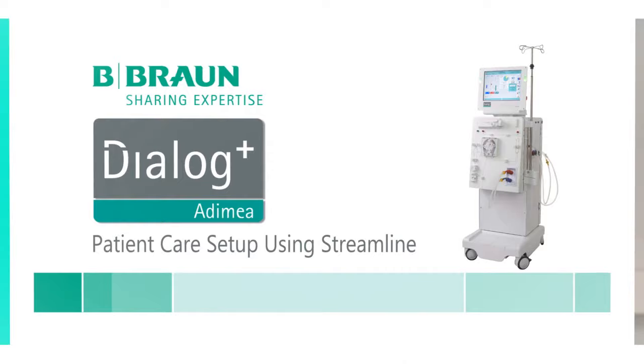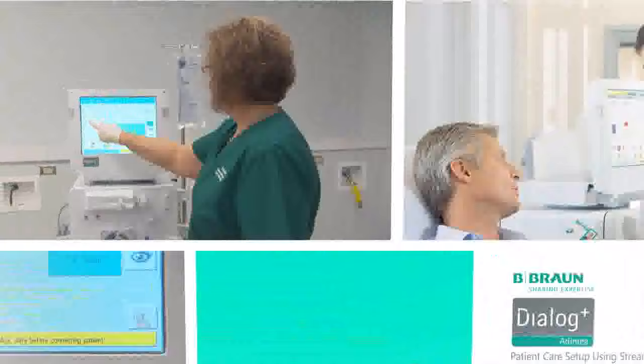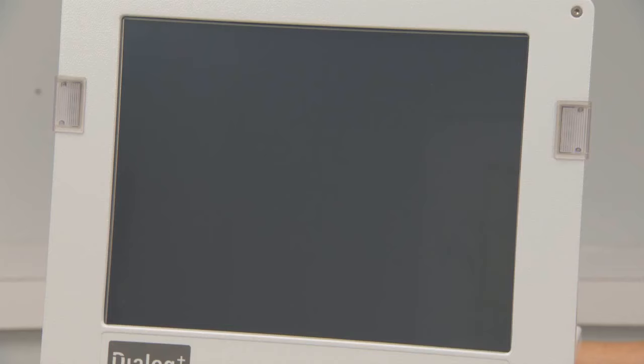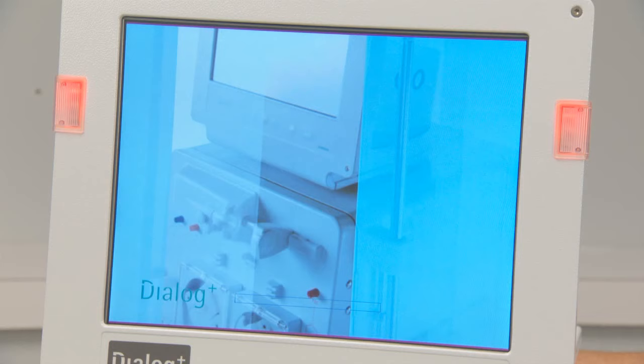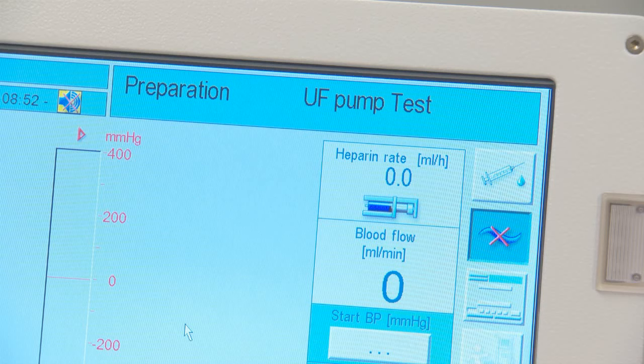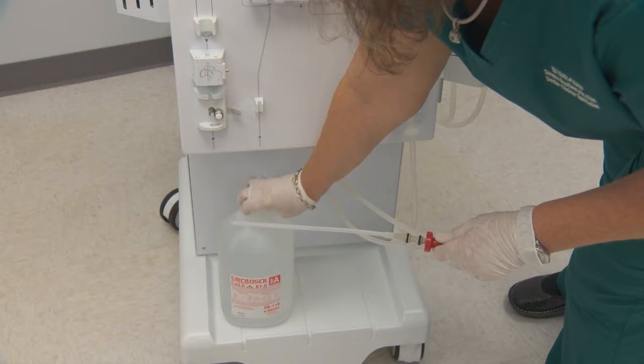The Dialog hemodialysis system operates seamlessly with the streamlined bloodline to provide optimal treatment quality for the dialysis patient. Once the Dialog is in preparation mode, it will automatically begin the self-tests. The acid and bicarbonate dialysate components may be connected immediately.